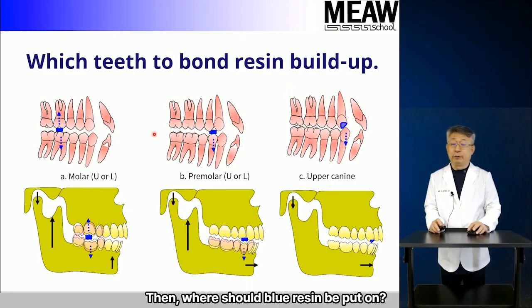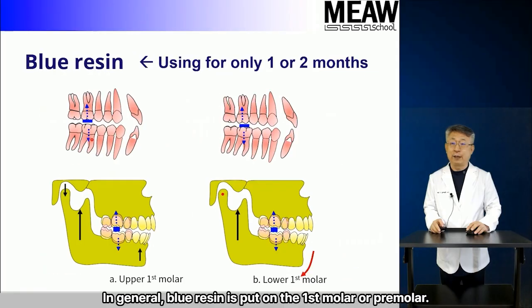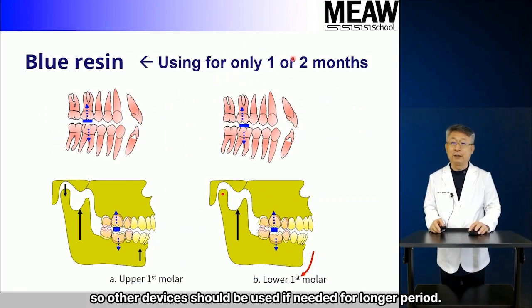Then, where should blue resin be put on? In general, blue resin is put on the first molar or premolar. Blue resin should not be used longer than 1 or 2 months, so other devices should be used if needed for a longer period.